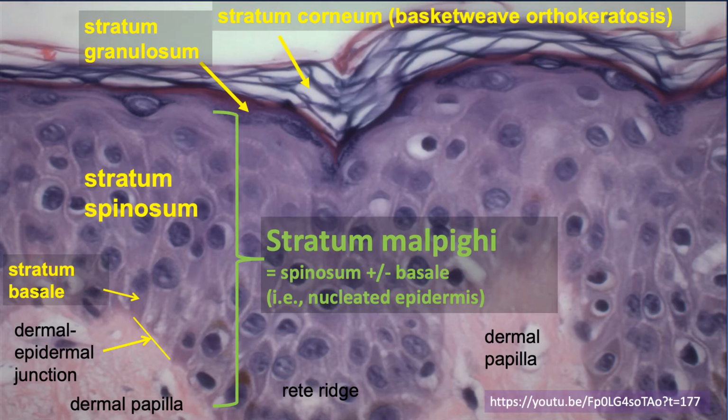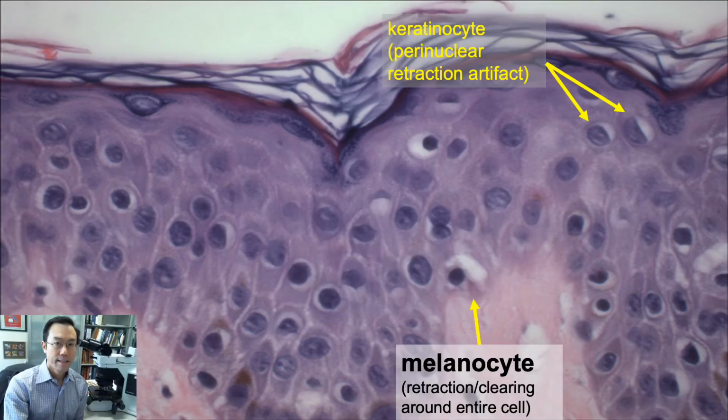In previous sessions, we focused on the keratinocytes as well as the melanocytes in the epidermis and some of the more common tumors that they make. In this session, we'll be doing a much deeper dive into a much fuller spectrum of histopathologic diagnosis of melanocytic tumors, but it still goes back very frequently to the fundamental principle of being able to identify a melanocyte at the H&E level as opposed to a non-melanocyte, usually a keratinocyte.